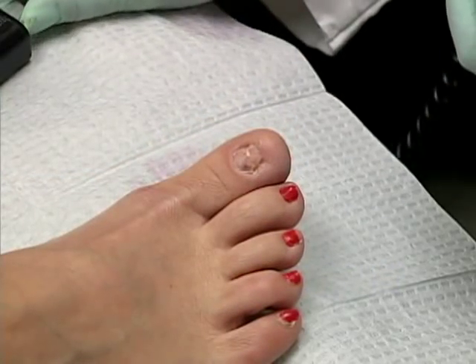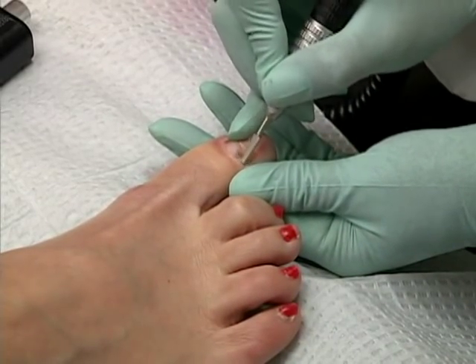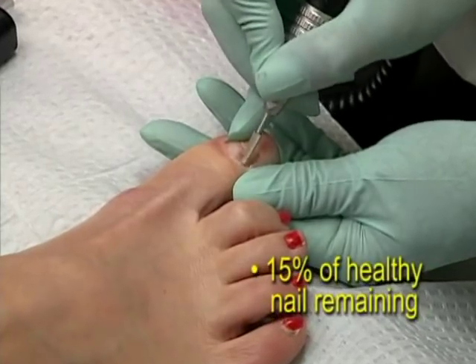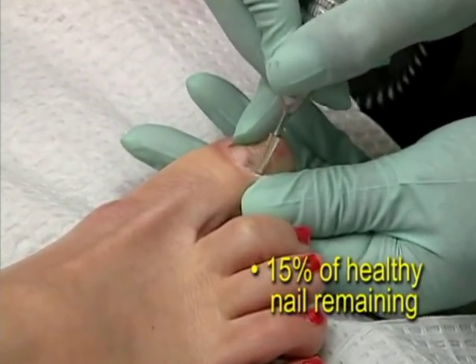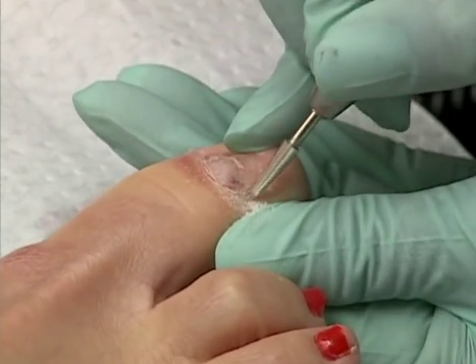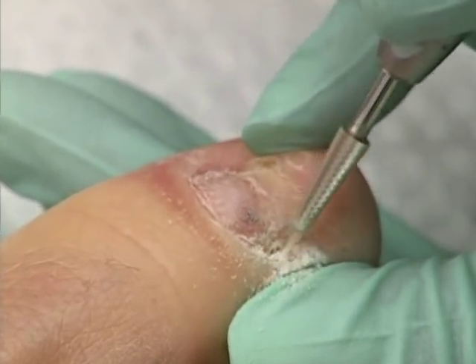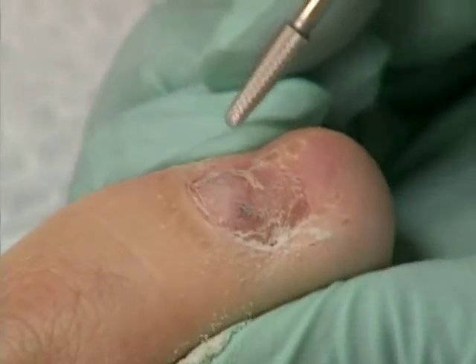The first step in the Keriflex procedure is removing as much of the damaged nail as possible. However, there must be at least 15% of healthy nail remaining for the resin to bond properly to the nail. As is typical for these cases, you can use a Dremel to remove flaky or discolored pieces of nail and to ensure a satisfactory cosmetic result for the patient.